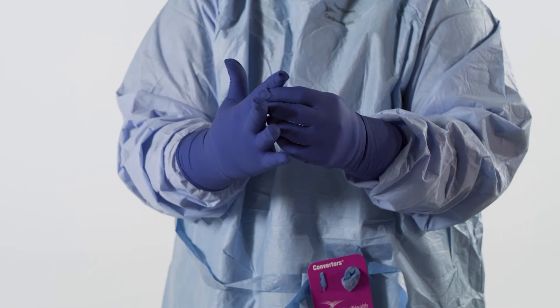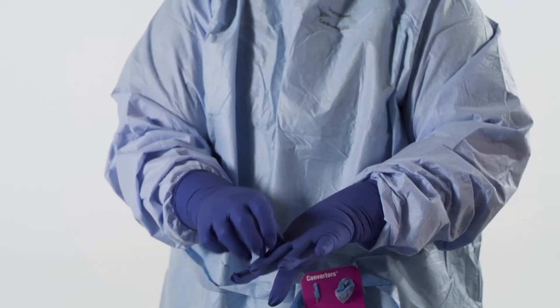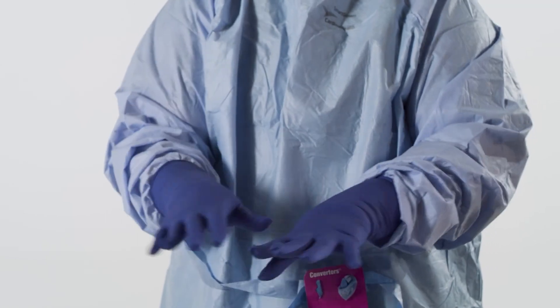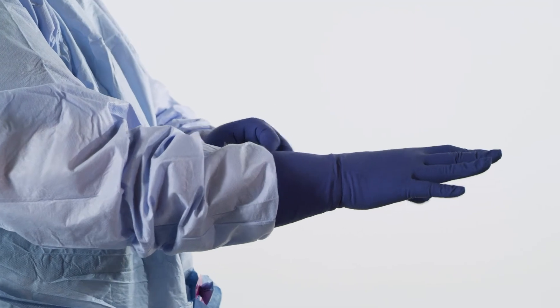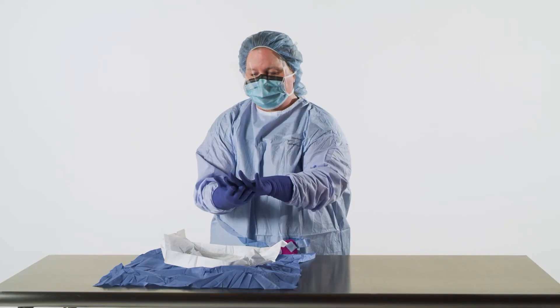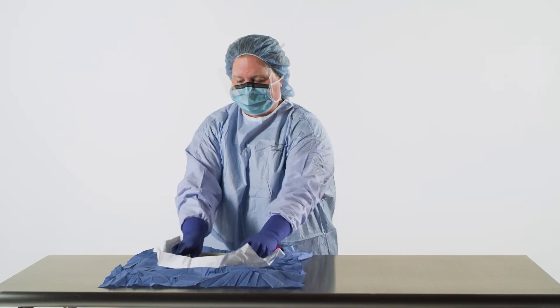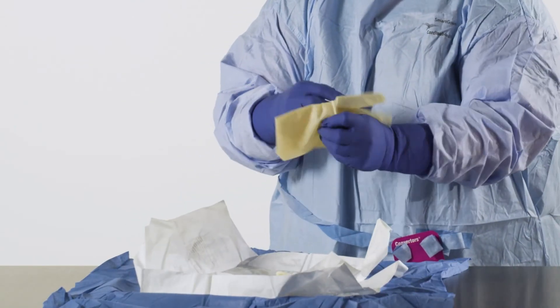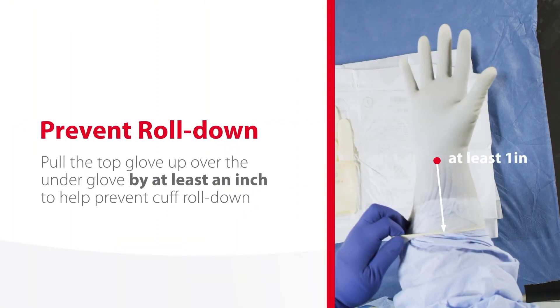Milk the fingers down if appropriate. Inspect all surfaces of the gloves on both hands and visually check for any tears or holes. Immediately after donning, flatten or smooth the glove cuff on the gown cuff interface to minimize channeling — this will help retain the integrity of the glove-gown interface. If double gloving, repeat this process. Pull the top glove up over the underglove by at least an inch to help prevent cuff roll down.